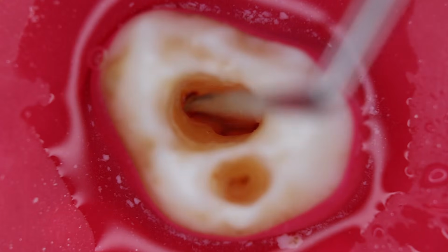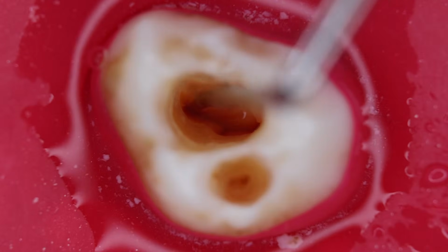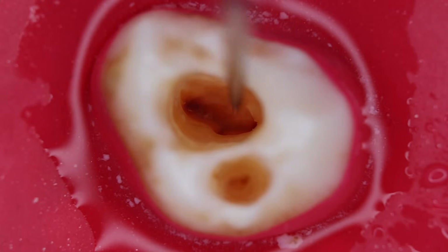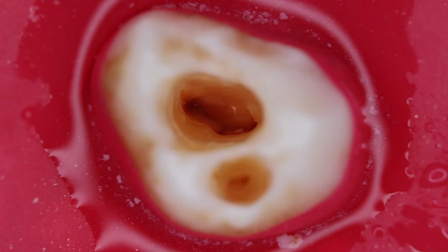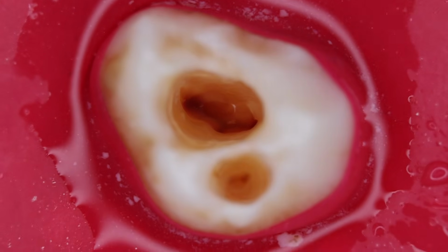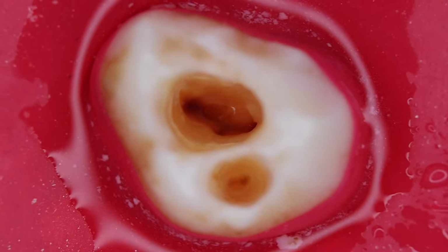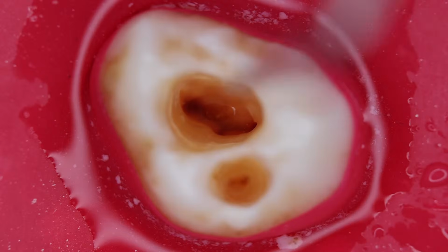So this one is the mesobuccal 1, this might be the mesobuccal 2, we would see it in the radiographs also. This is the distal canal orifice, and over here this one is the palatal canal orifice. Hope you are able to visualize these 3 large openings, the dark circles, as you can see over here.